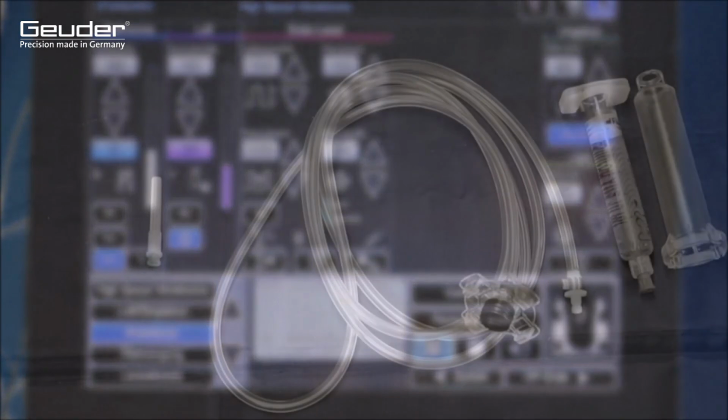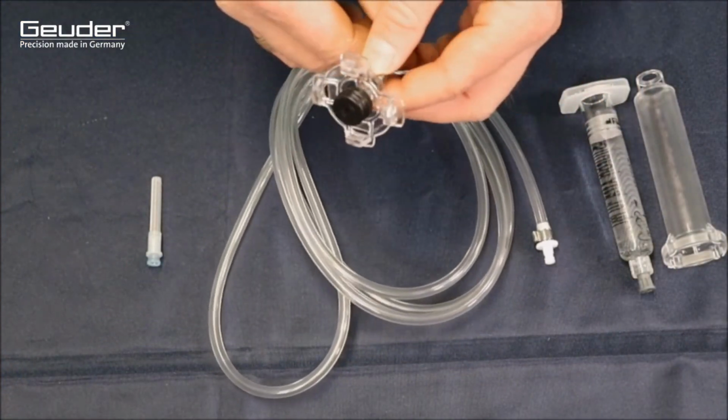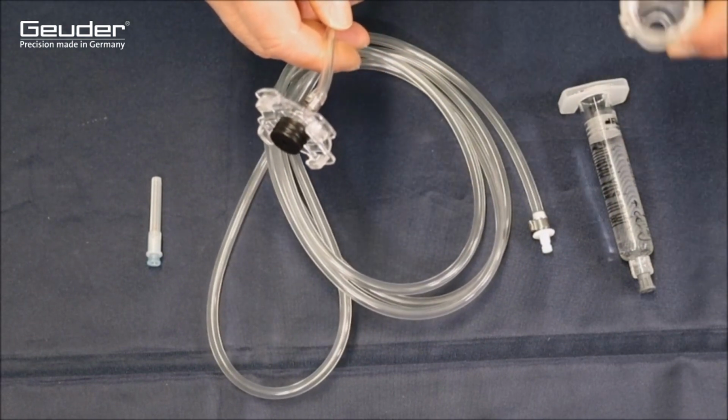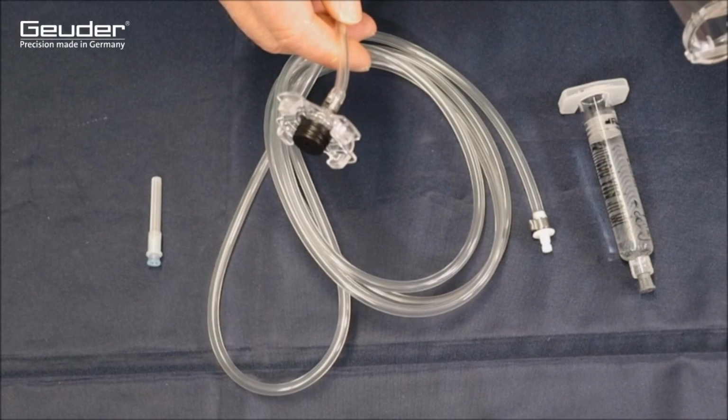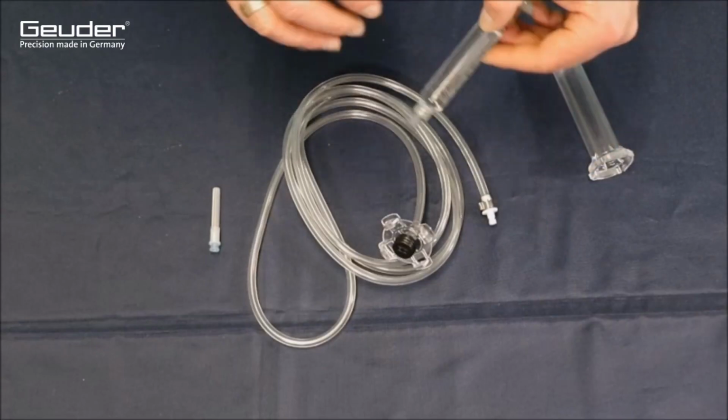Finally, we look at the oil injection system, which consists of a connection hose with a connector to the device system and a screw cap for a safety cartridge that is also included. A VFI cannula can also be used with the oil injection system.